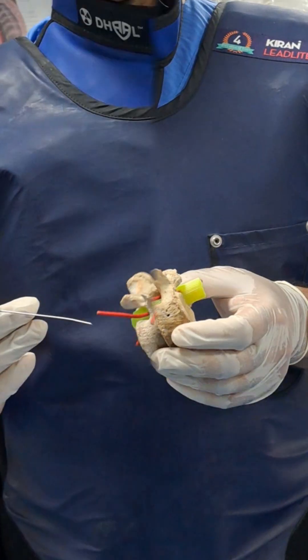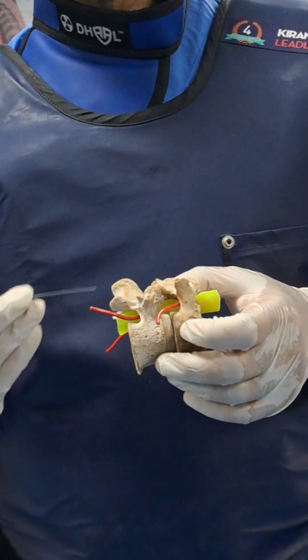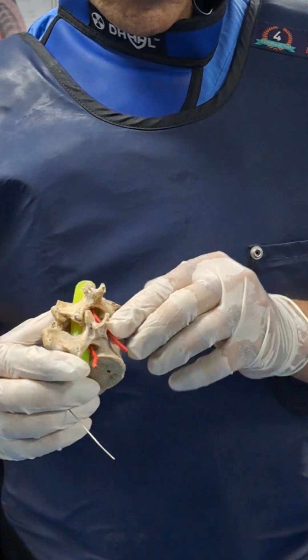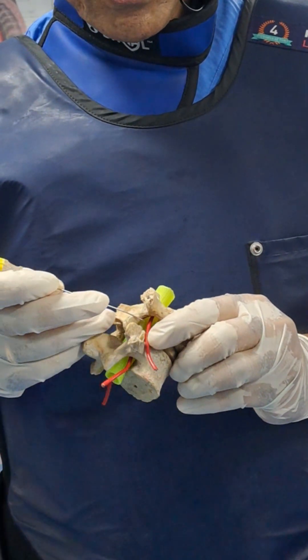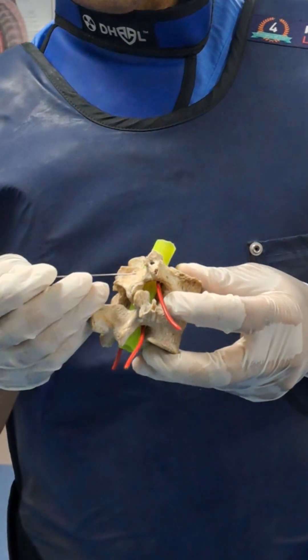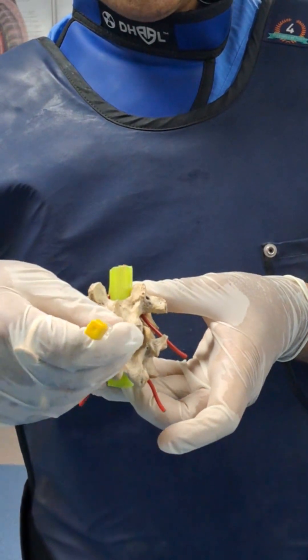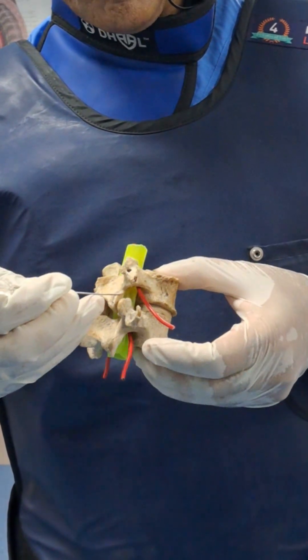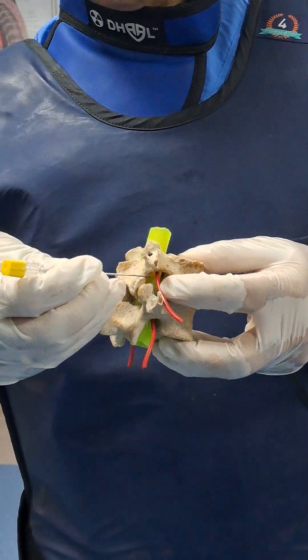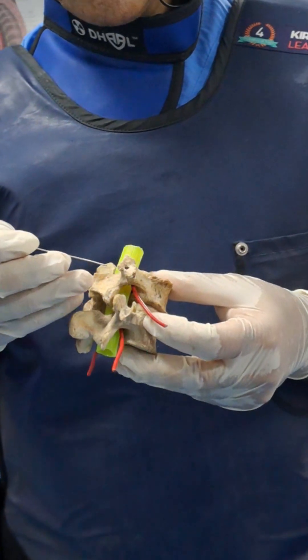Now I will show the dorsal ganglion RF procedure. We have already seen the cadaveric demonstration of the dorsal ganglion and understood its position — just inside the foramen. If you see this model, the dorsal ganglion will be a little inside the foramen. To block it, the needle cannot be straight; it has to be a little oblique to go inside the foramen, keeping the needle posterior to the dorsal root. For every procedure, find the last bony point first.